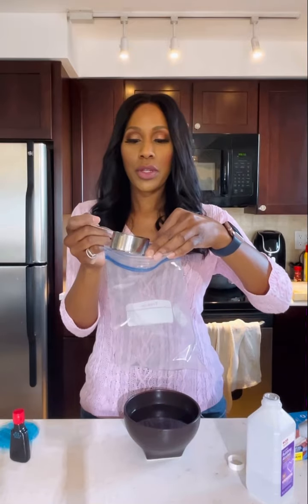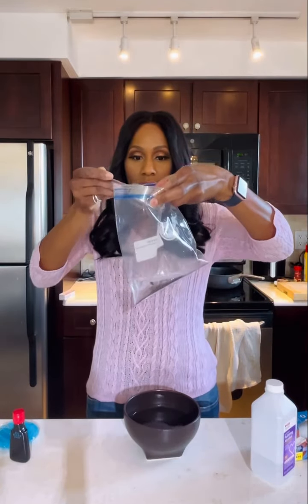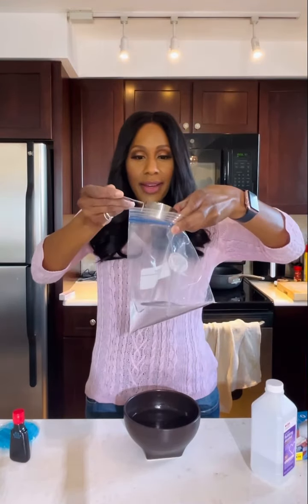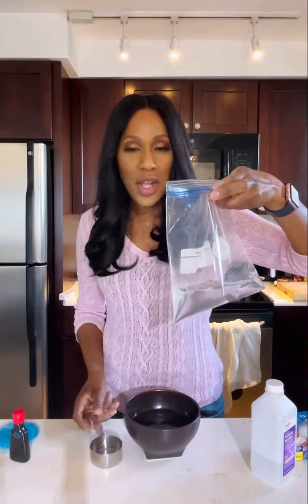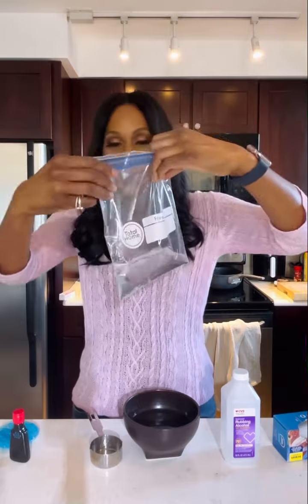Okay, here we go. Don't spill. There we go. Okay. So we got 1 part rubbing alcohol, and I used 1/3 of a cup as my measurement tool. And then what we do, hold on. So exciting. Oh, I've been wanting to do this with you guys for a long time. The next thing we do is we do 2 units of water, okay? So I got my 1/3 of a cup. We got 1, the water, we're gonna put it in here, and we got 2 units of water, okay? So once again, it is 1 part alcohol to 2 parts water, all right? And this is the beginnings of our gel ice pack, all right?